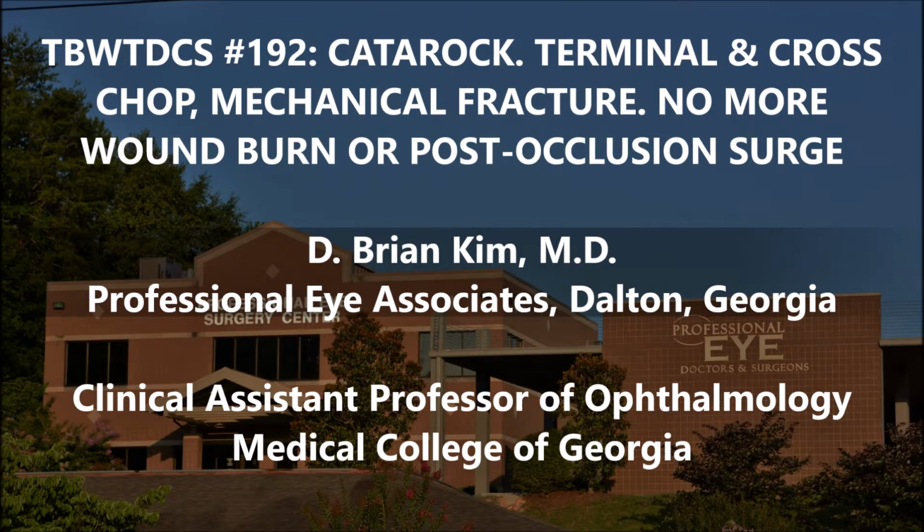You're going to see hooking the peripheral lens with the chopper and positioning the phaco tip deep within the bag. This allows you a more effective complete chop, and this helps you avoid and bypass the posterior plate phenomenon. No more wound burns and no more post-occlusion surge and the risk for posterior capsule rupture.